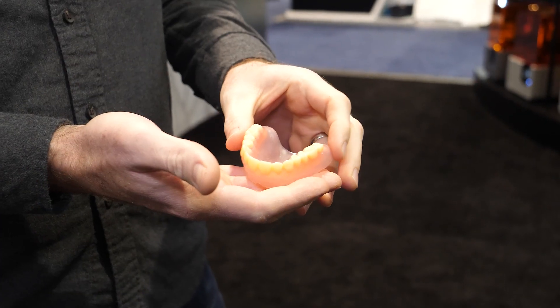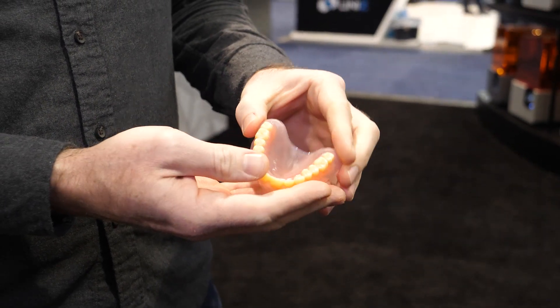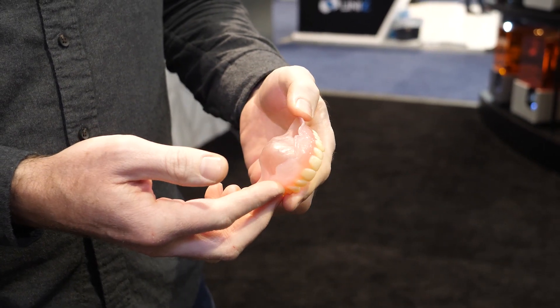The other new material is a little grizzly maybe — this is a 3D printed denture. It's a completely 3D printed denture: you print the gums and the teeth separately with different materials and then assemble them together. This means the entire process of making a denture can be digital. Your dentist scans your mouth, it gets sent to a technician who creates a design, and then you 3D print it and send it back.